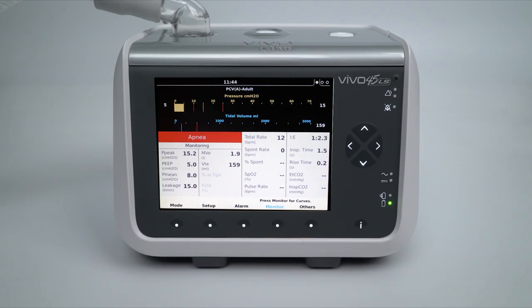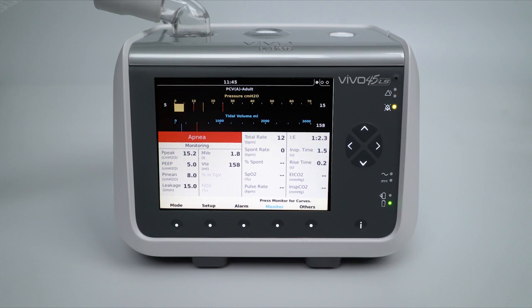An audible signal can be silenced using the alarm silence button. When pressed, the audible signal from the activated alarm only will be silenced for 60 seconds. An additional LED will illuminate to show the alarm is currently silenced.